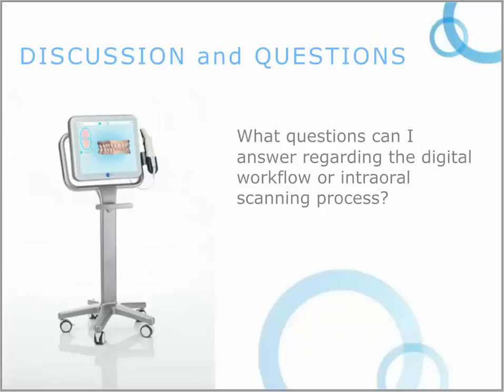I don't think there's a difference between impression taking, and I don't think you should look at it that way, as a difference between impression taking and management of the soft tissue. That really should be held on the same level.